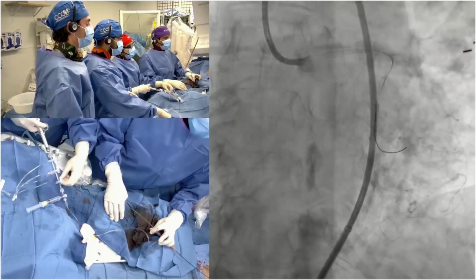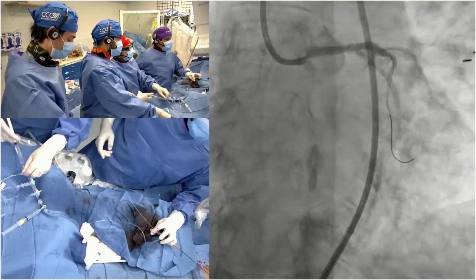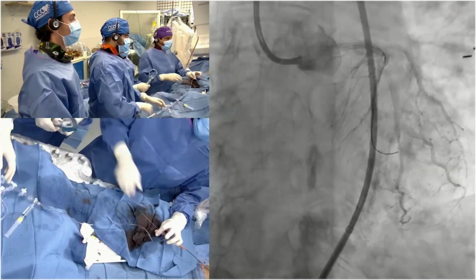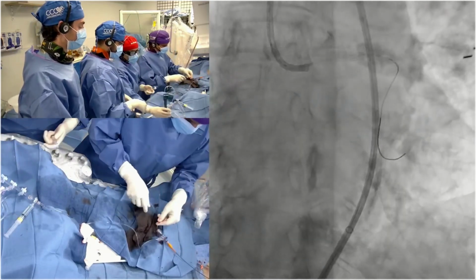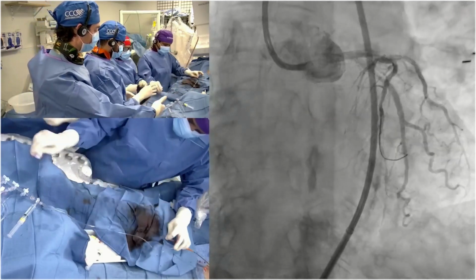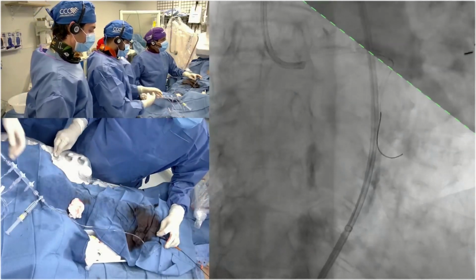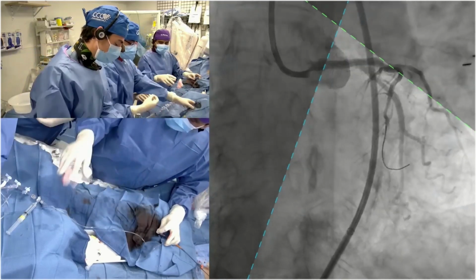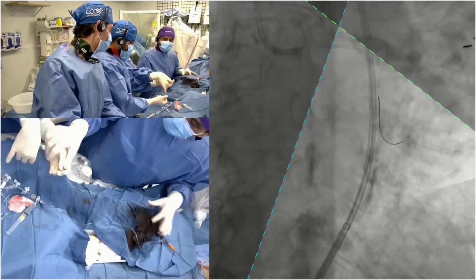Excellent point. Okay. You definitely don't want to miss the ostium, and remember that the left main is not flush perpendicular to the aorta, right? So to cover one side, you have to have some degree of protrusion on the inferior side, and if you miss that, you've missed everything. As a result of the protrusion, though, you do have some propensity for distortion.